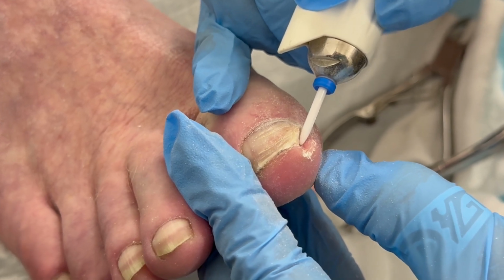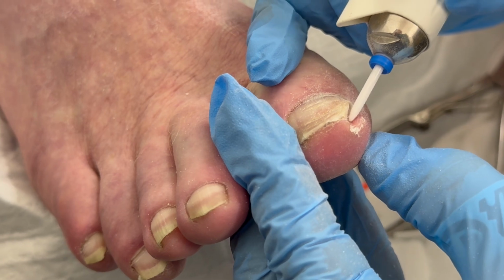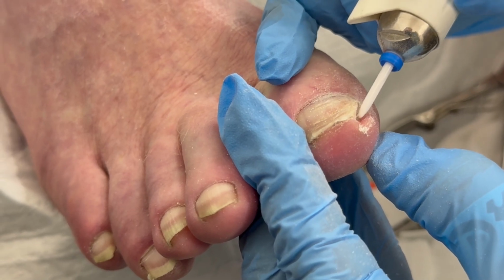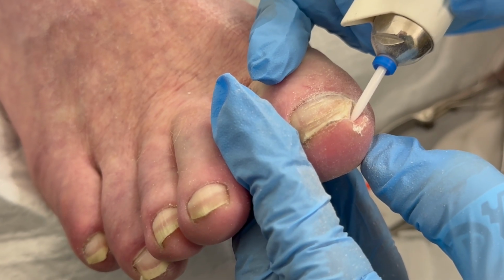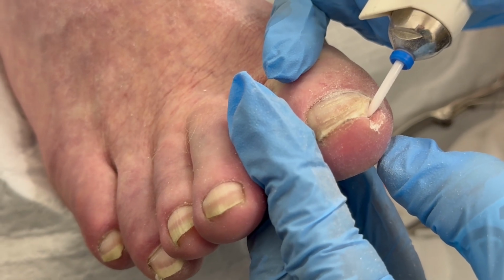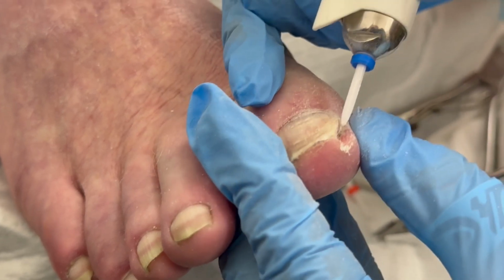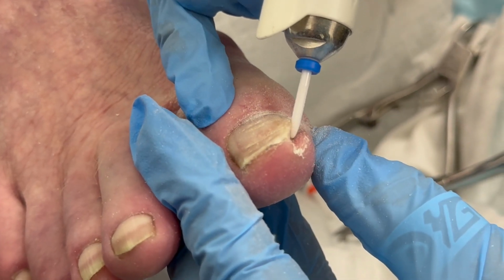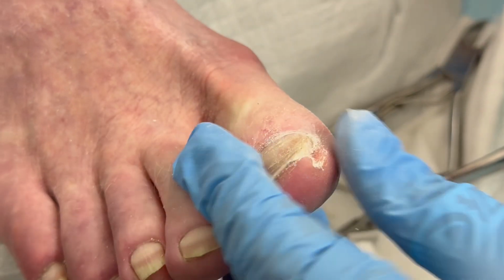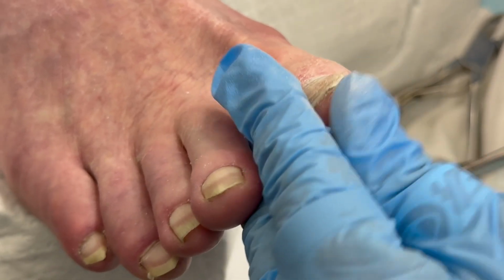And the other thing is when you do this enough, you kind of become one with the pointy bit. And I can tell when it's hitting nail versus skin. It's so hard to describe, when I become one with the pointy bit. Okay, how's that feel? Much better. Yeah, the pressure isn't there at all.